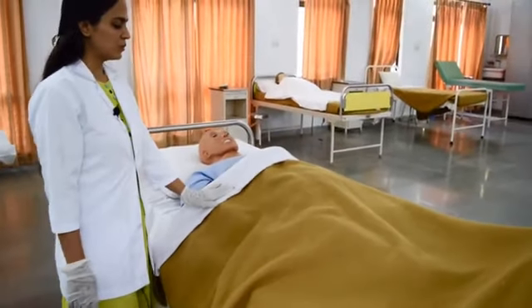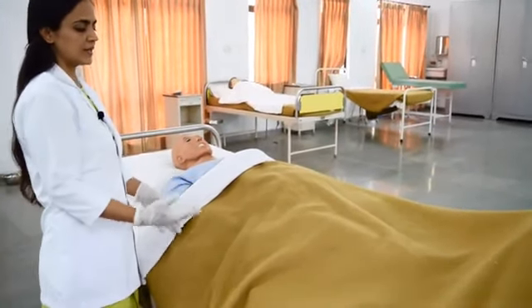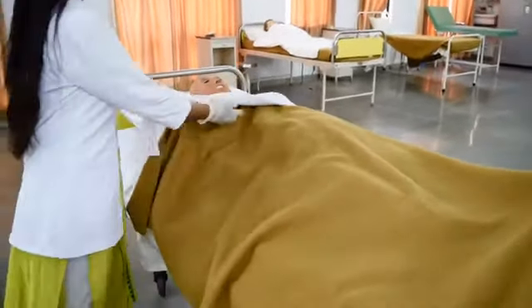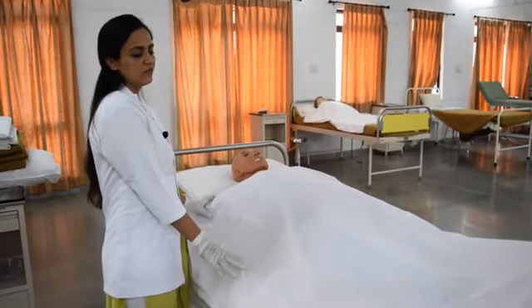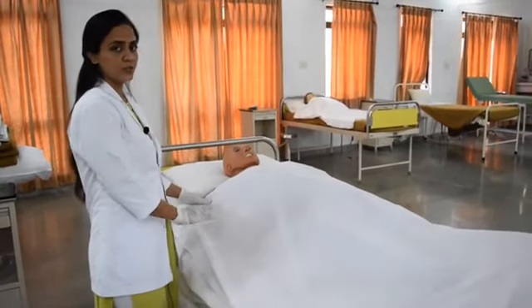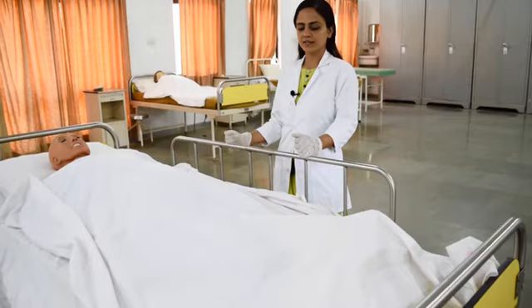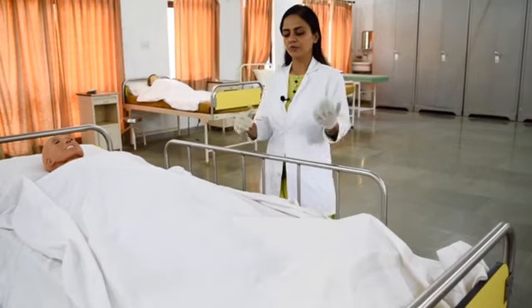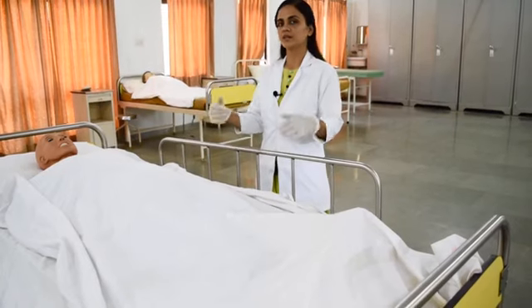Now we have to take off this blanket, separate it, fold it nicely and keep it aside on the chair of the patient. The top linen we will keep like this only, to maintain the privacy of the patient. Now we will come to the other side. On this side we will keep the railings up, then place a pillow in between the patient and the railings, right? And then we will turn the patient.